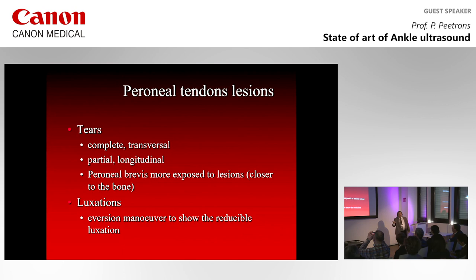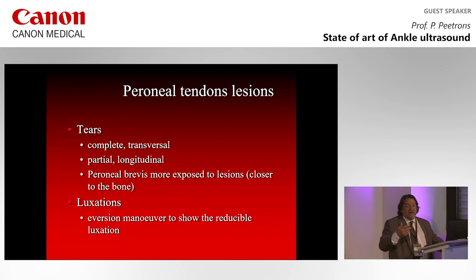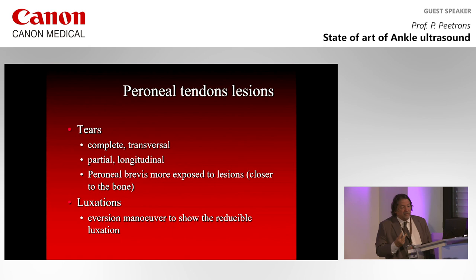If you see a neuroma, you inject the neuroma with anesthetic first or with steroids to have a therapeutic test. And then the patient says, oh, I don't feel anything anymore. And you are the hero of your hospital, okay? Because he or she has already been injected 5 times around the tip of the malleolus without any difference, okay?